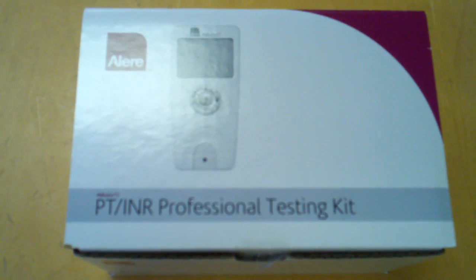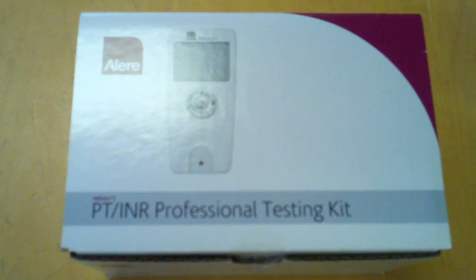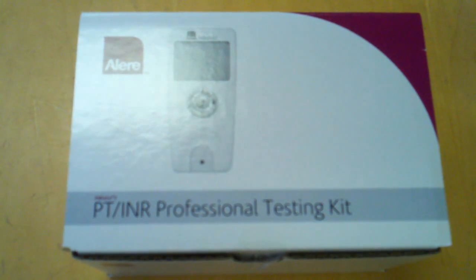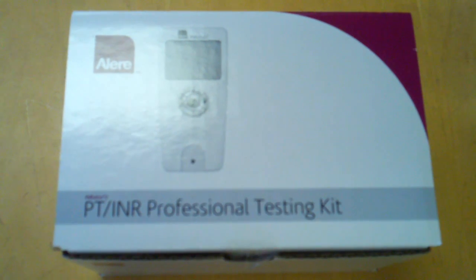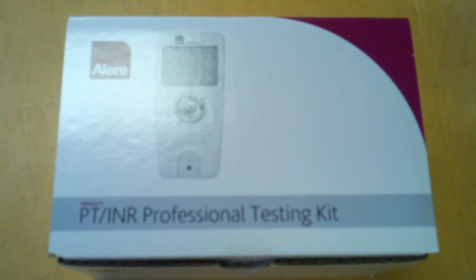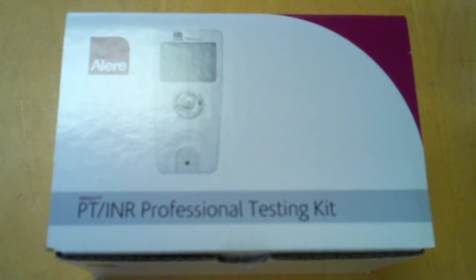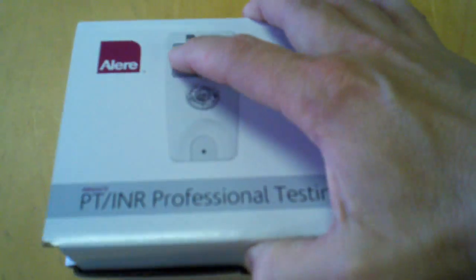Hi, you are looking at the new PT-INR Professional Testing Kit from GoSouthernMD.com. Right now, when you order the first generation, which is the older model, we are doing a free upgrade, which is about a $300 upgrade. Let me go ahead and open this up for you so you can take a look at what you get when you order the kit from GoSouthernMD.com. This is the brand new model that we just received in.